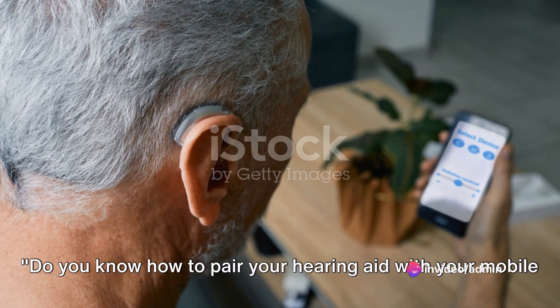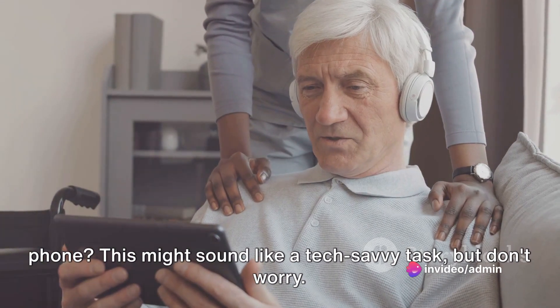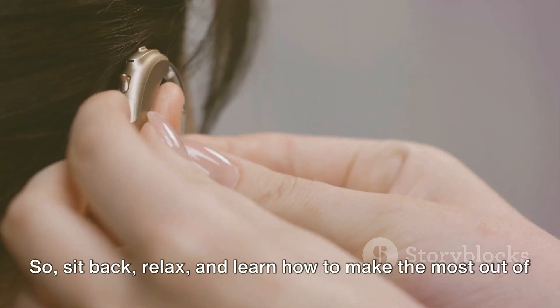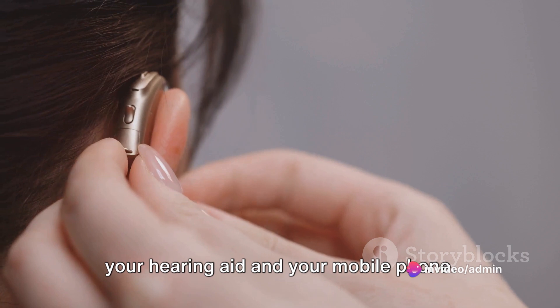Do you know how to pair your hearing aid with your mobile phone? This might sound like a tech-savvy task, but don't worry. It's actually quite straightforward, and it opens up a whole new world of better hearing. So sit back, relax, and learn how to make the most out of your hearing aid and your mobile phone.